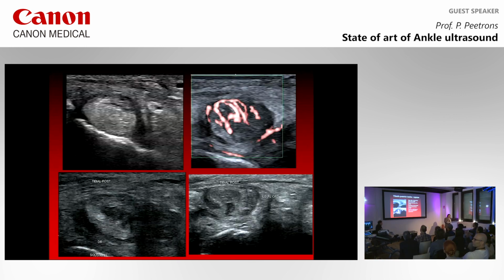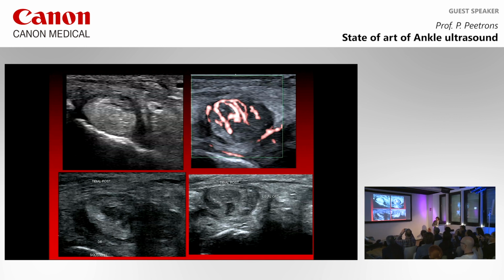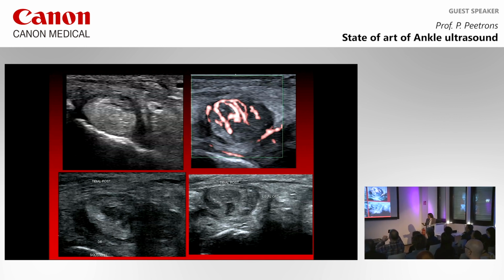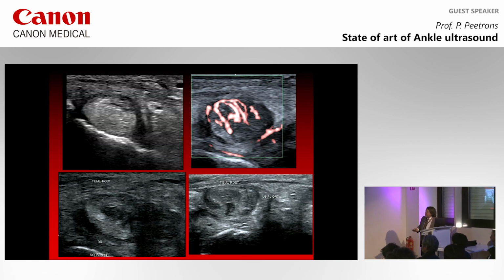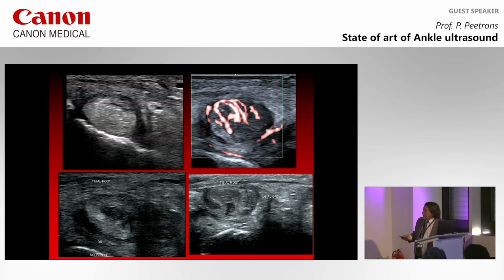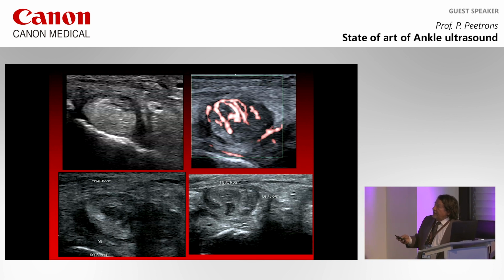I will end with these images that we can see now with tendon lesions. You can see very clearly little clefts inside the tendon, little holes and clefts inside the tendon. This is all tibialis posterior. And with the microvascular imaging, you can see hypervascular imaging of the tendon, which is clearly abnormal.